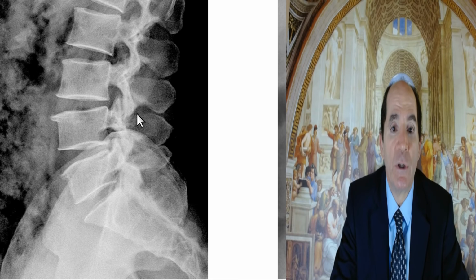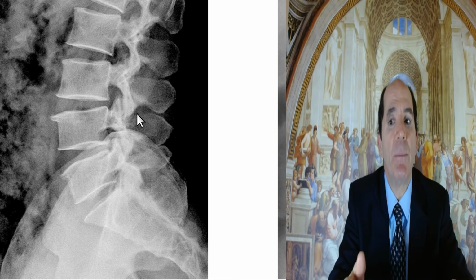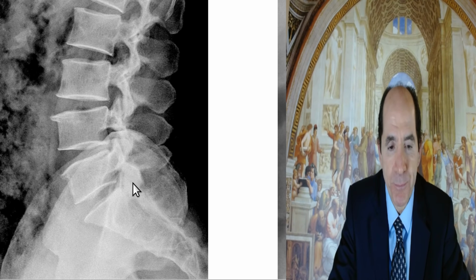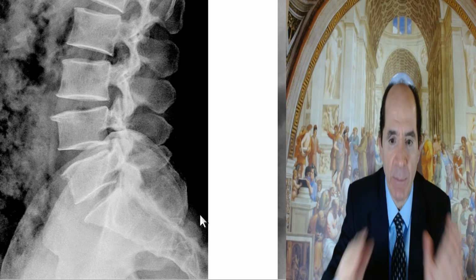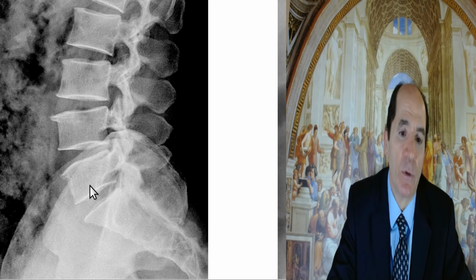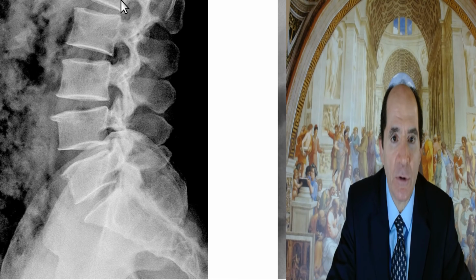This is a relatively normal patient. What I'm saying is I can judge the patient's age pretty accurately by looking at their lumbar spine plain film. So here's the sacrum. It's all one tubular piece, kind of shaped like a cone. And then the first rectangular vertebral body is L5, L4, L3, L2, L1. That means lumbar 1, 2, 3, 4, 5.